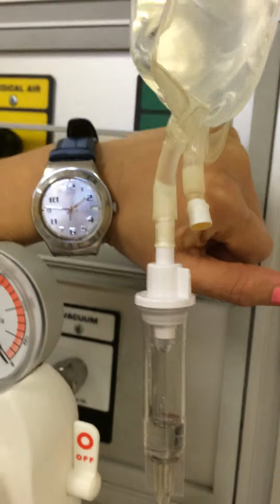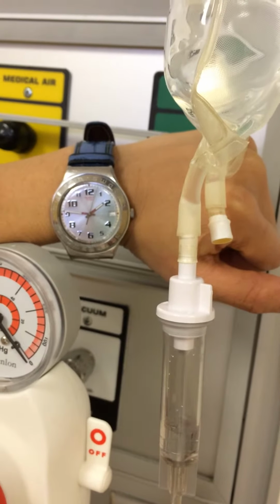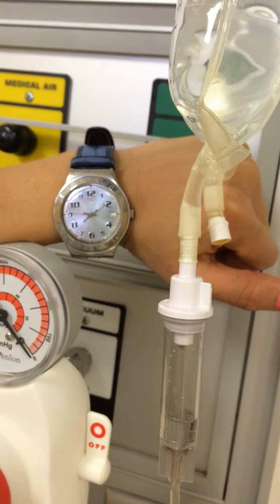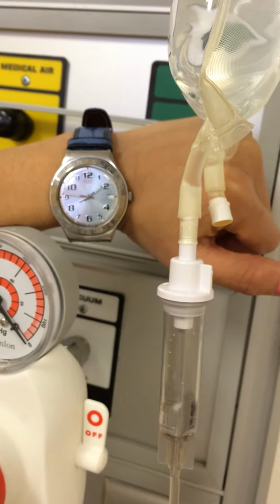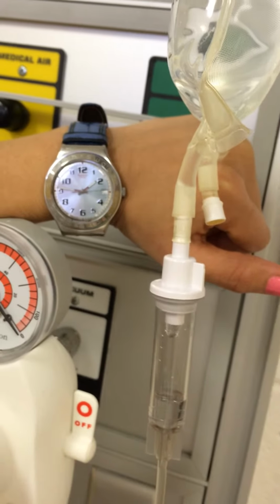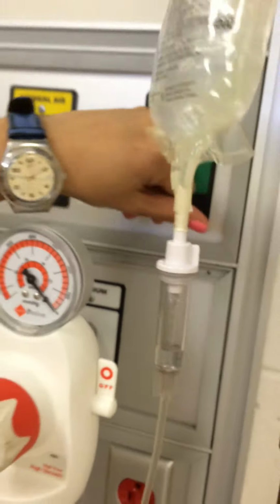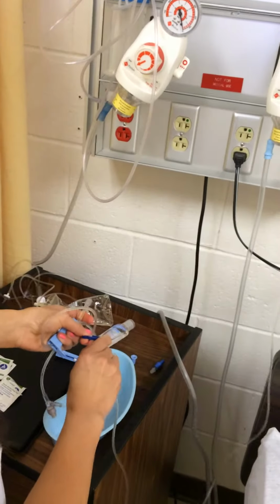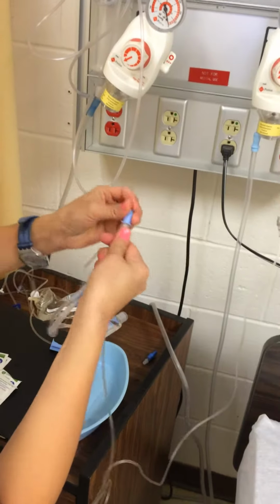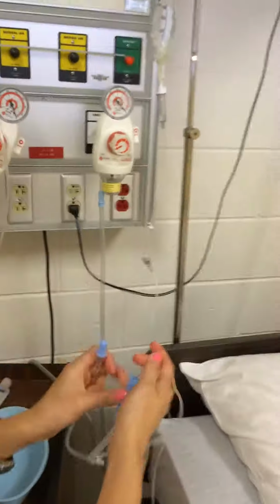Okay, I start to count: 2, 3, 4, 5, 6, 7, 8, 9, 10, 11, 12, 13, 14, 15. Okay. So I clamp it, and I close the tubing before I give it to the patient.